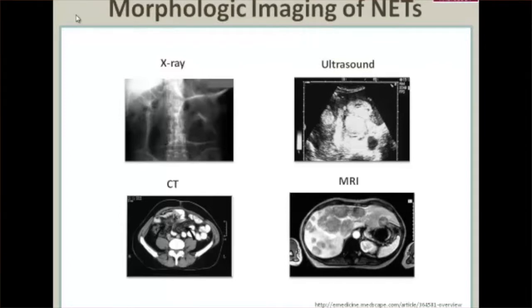Getting on a plane is a lot easier than getting into one of these MRIs because of the strong magnetic field. While you're in that scanner, radio frequency waves jar the magnetic field, and that's how we get the images, and that's when it's loud. So the MRI gives tremendous detail about soft tissue, and one of the important points that we'll come back to is that it doesn't use radiation.